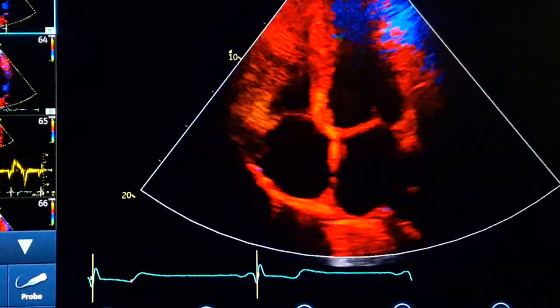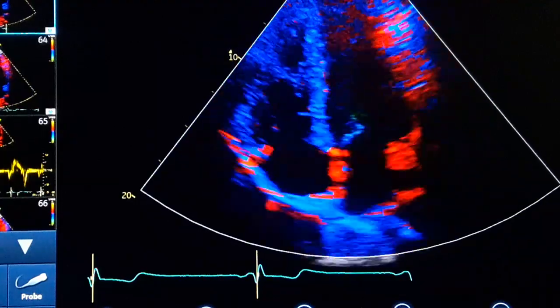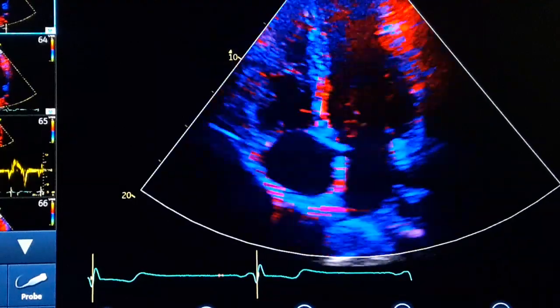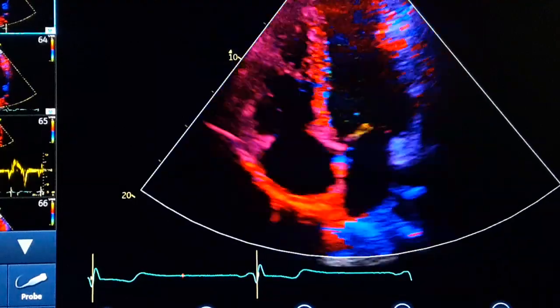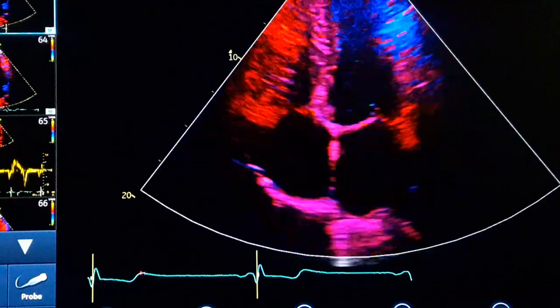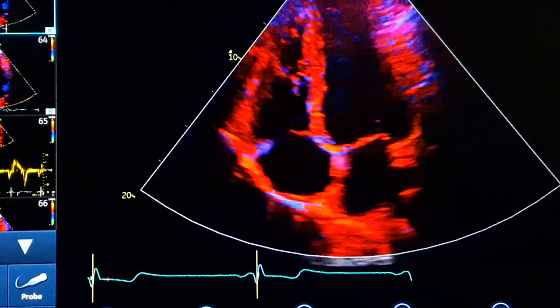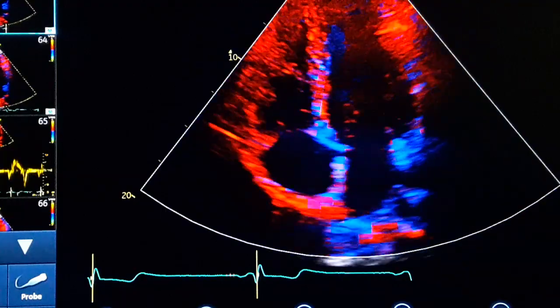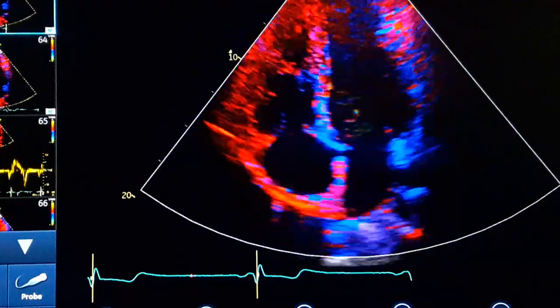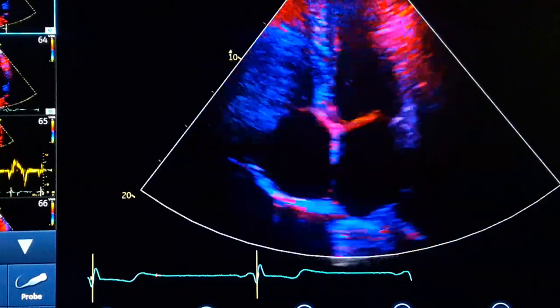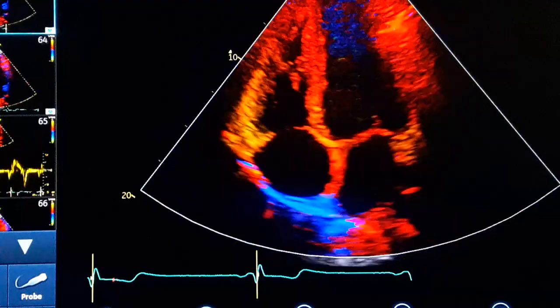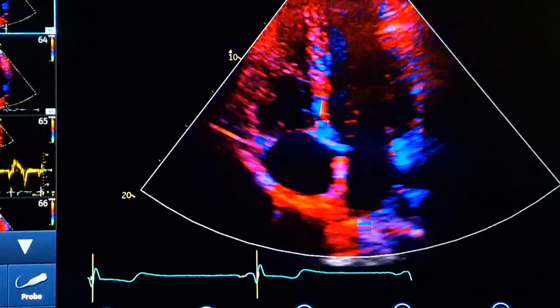Left ventricular tissue Doppler measurement. One of the most important evaluations for diastolic dysfunction of the left ventricle is tissue Doppler.